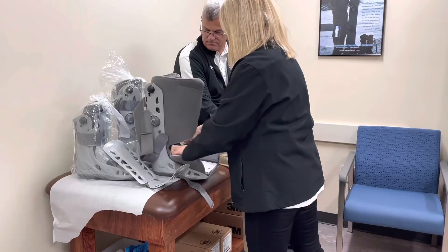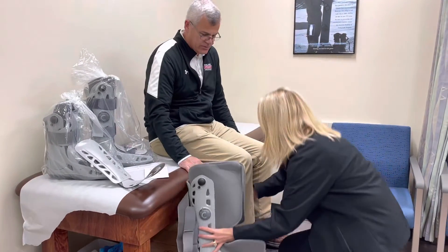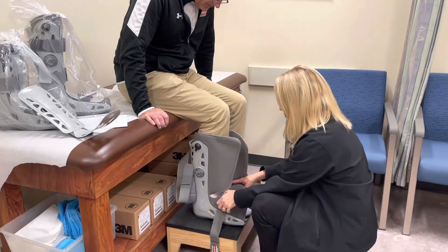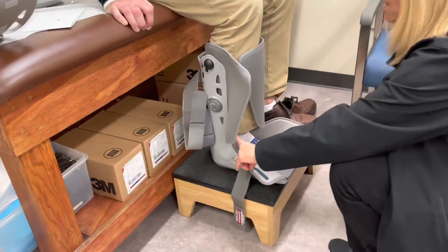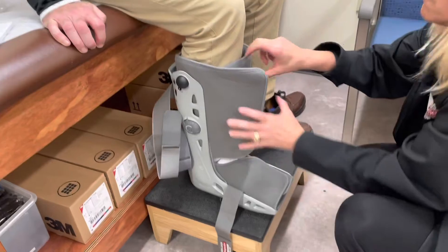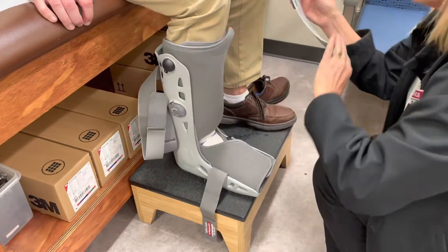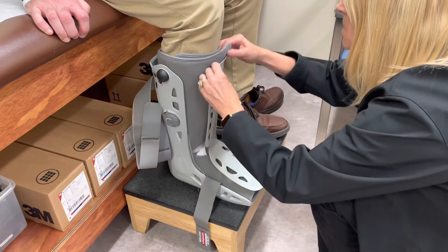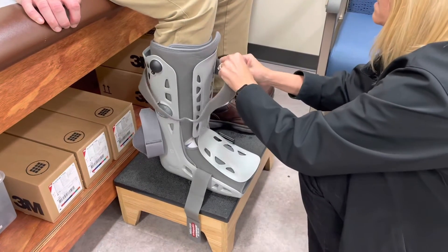Open up the boot. This is pneumatic — we have some that are pneumatic as well. We're going to pump it up. Pull the top piece off and open the boot. Make sure there's enough room so the toe does not come off the edge. Fasten that, put the top cover on — the logo always goes on the bottom. Then we have three straps to secure it in place.